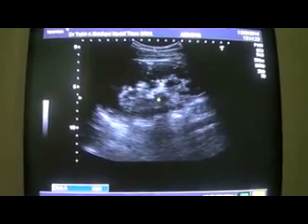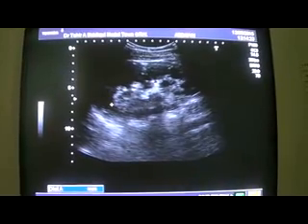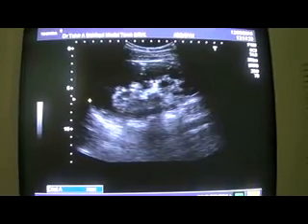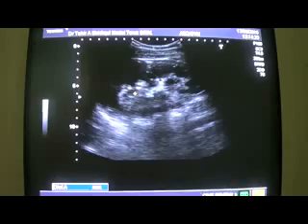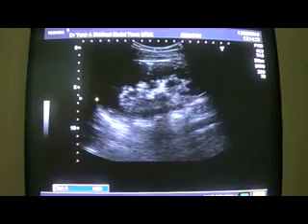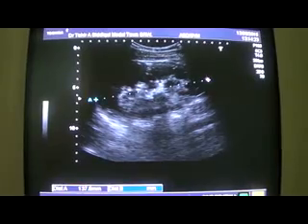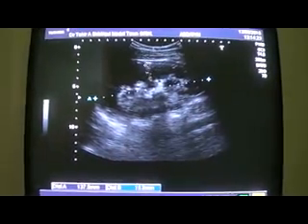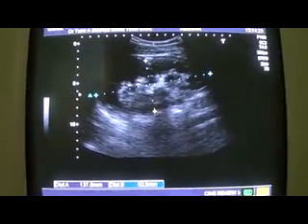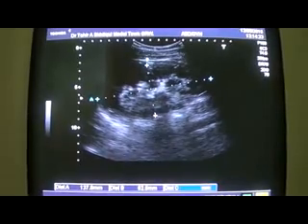This is the left kidney frozen on the ultrasound, that of a 22 years old male. This is the longitudinal section, and it measures 13.7 centimeters in length and 6.25 centimeters in anterior-posterior diameter.